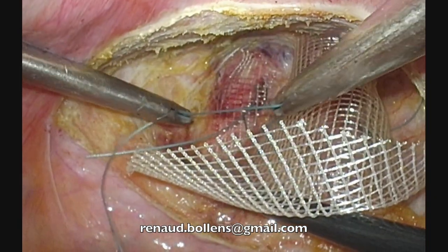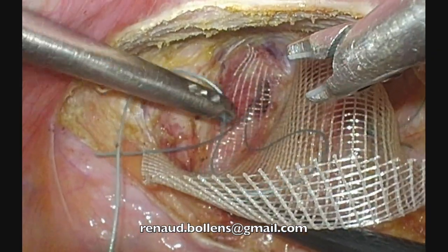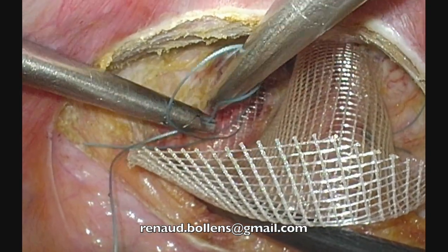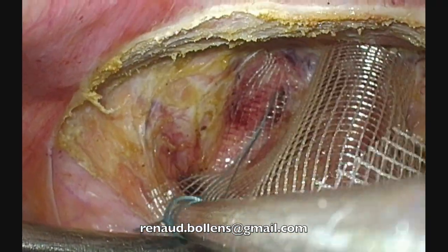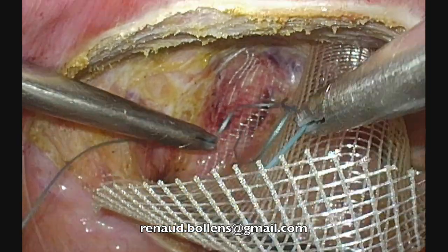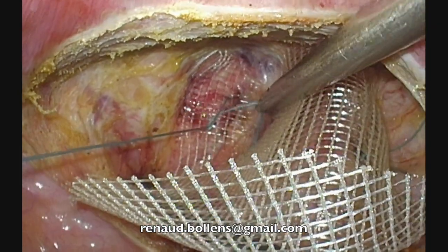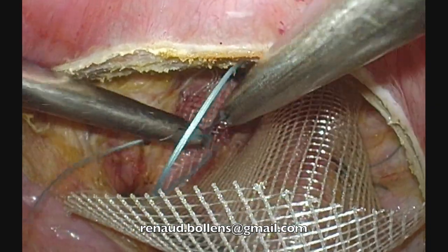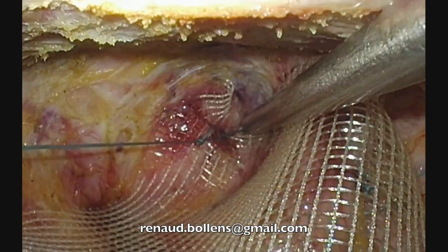If you want to do a double knot, the basic technique of the double knot is that you turn two times; the beginning is the same. You turn the left hand, traction of the suture, you turn two times, you always do a double knot for the first one, you catch the short thread, and to come out, I pull the short thread through the two loops. But when I tighten, I just come back with my right hand close to the fixed point to not have a very long one on the right, and I close my knot. Okay? And I come here, half loop, jump over, and I tighten.